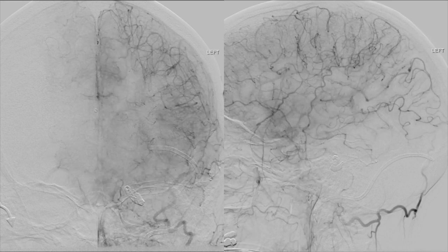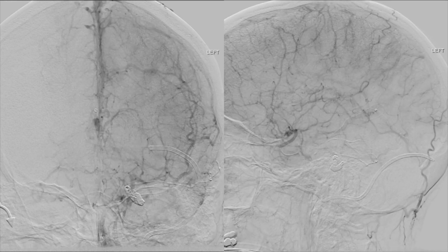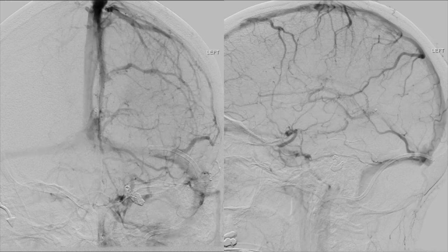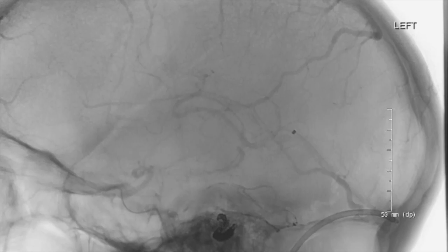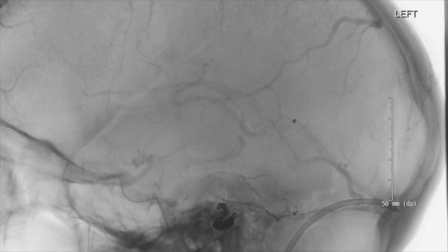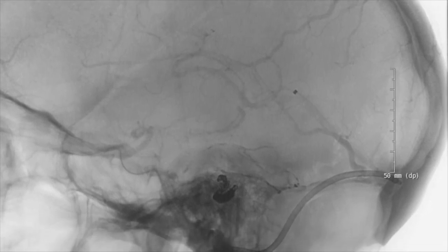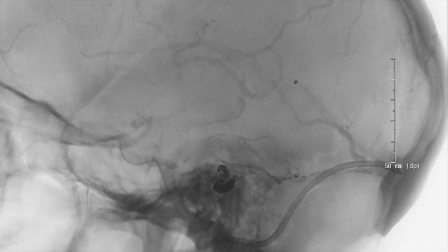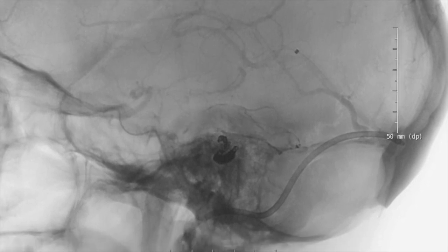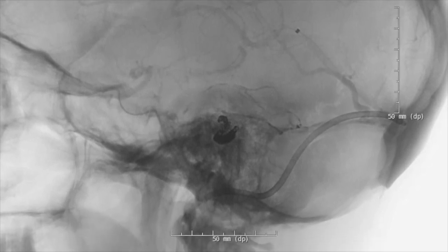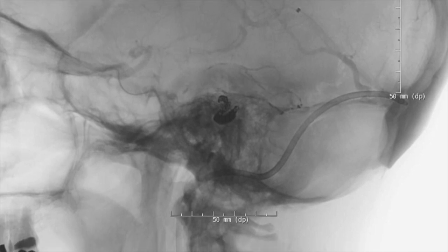Clinically, the patient tolerated the procedure well and has been seen in follow-up six months later, neurologically intact and with improvement of her initial symptoms. In summary, the anatomic features of this tentorial fistula made liquid embolic embolization potentially problematic and showed a valuable role of transvenous coil embolization to achieve definitive cure.